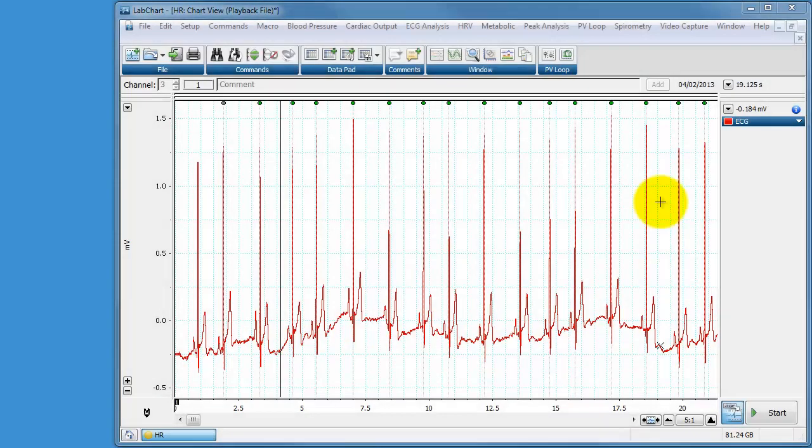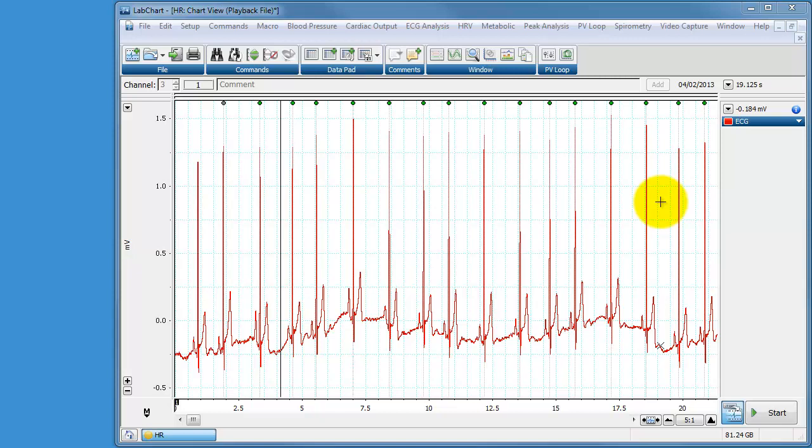Hello, this is a quick demonstration of how to use a macro in LabChart in order to automate what would be a rather laborious repetitive job.